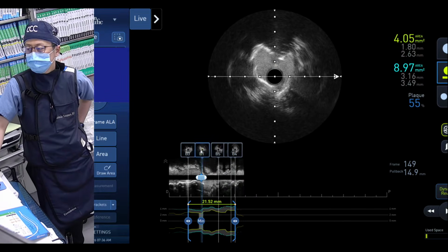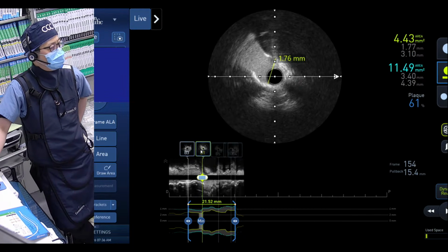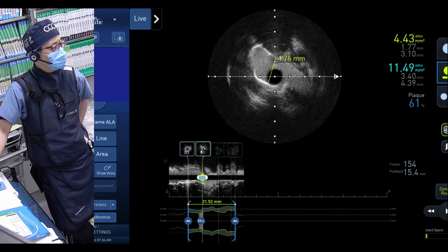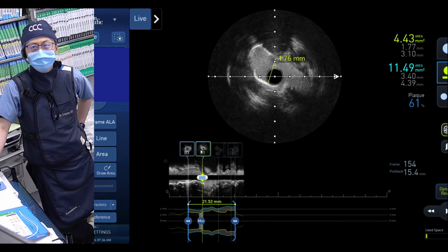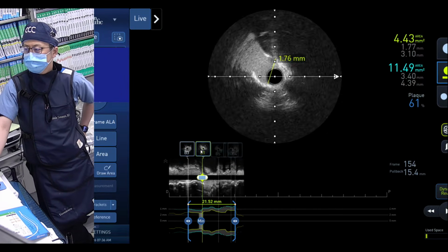Okay. And also the data we learned from the Shortcut trial, that after rotational atherectomy you do a cutting balloon or IVL. The advantage basically was that if you did not do the rotational atherectomy, IVL was better than cutting balloon. But if you have done rotational atherectomy, then a cutting balloon could be a routine strategy, and you can avoid putting in an IVL based on the trial.